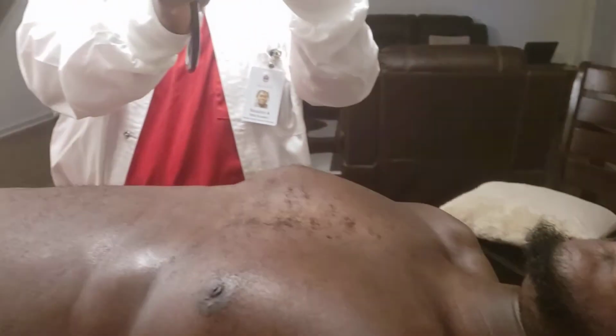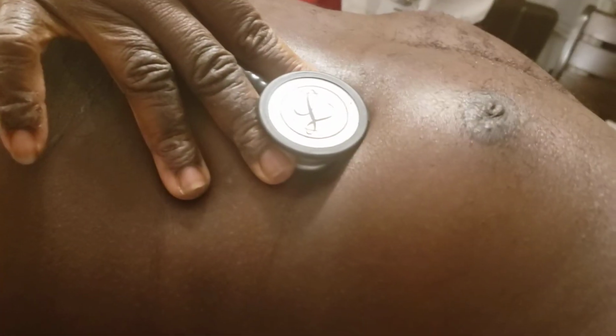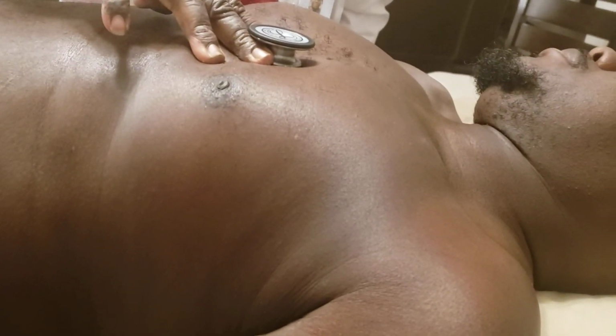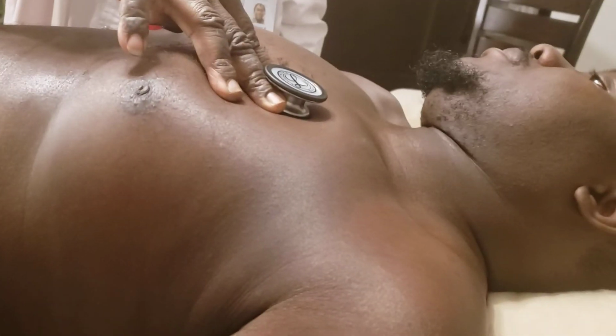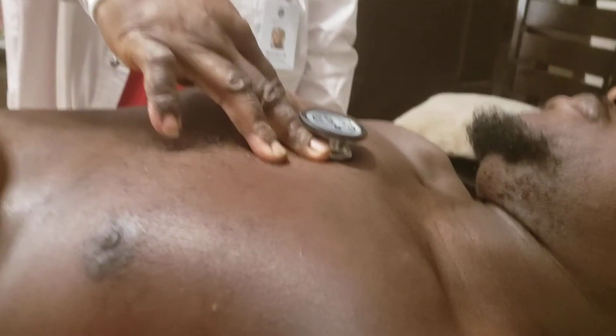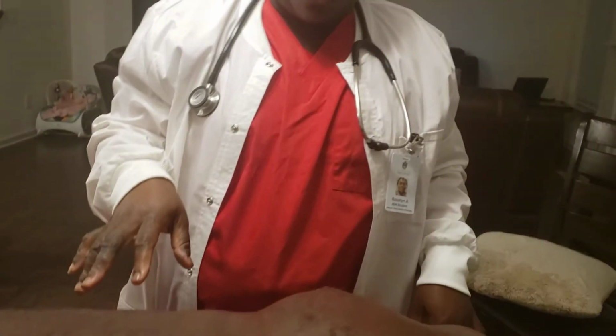Now I'm going to use the bell part of my stethoscope. I'm going in reverse to listen for any extra sounds, like a murmur, S3, or S4. So I go to the mitral valve. I'm not hearing any extra sound. The tricuspid, I move to Erb's point, then the pulmonic point, the second intercostal space, and then the aortic space. All sounds are very clear. There are no thrills, no murmurs, no S3 or S4 sounds.